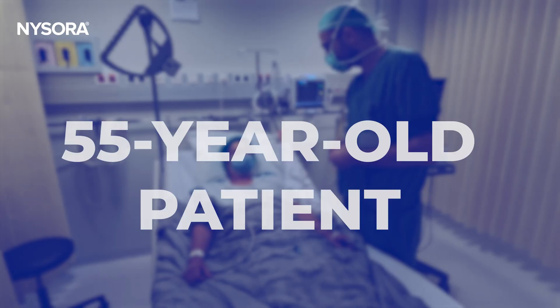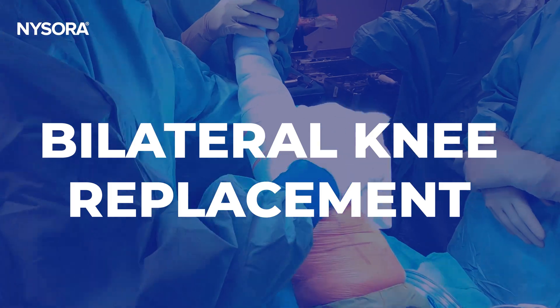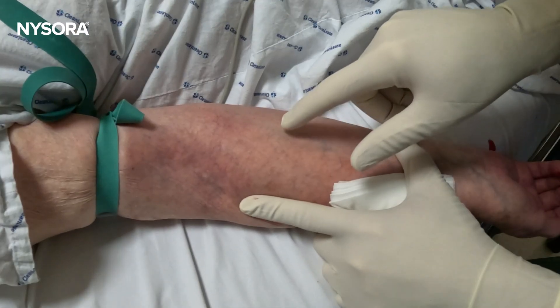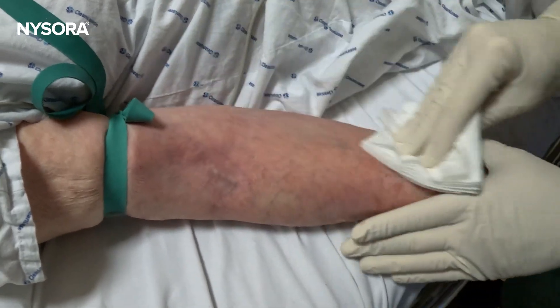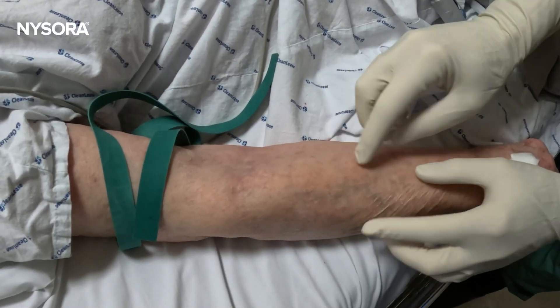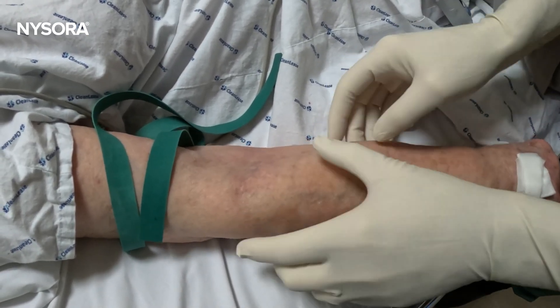In this video, we'll focus on a 55-year-old patient scheduled for bilateral knee replacement surgery. Normally two large-bore IV catheters are standard for this clinical scenario, but our patient's long-standing type 2 diabetes has rendered his veins fragile and tortuous, making them prone to blowing up.